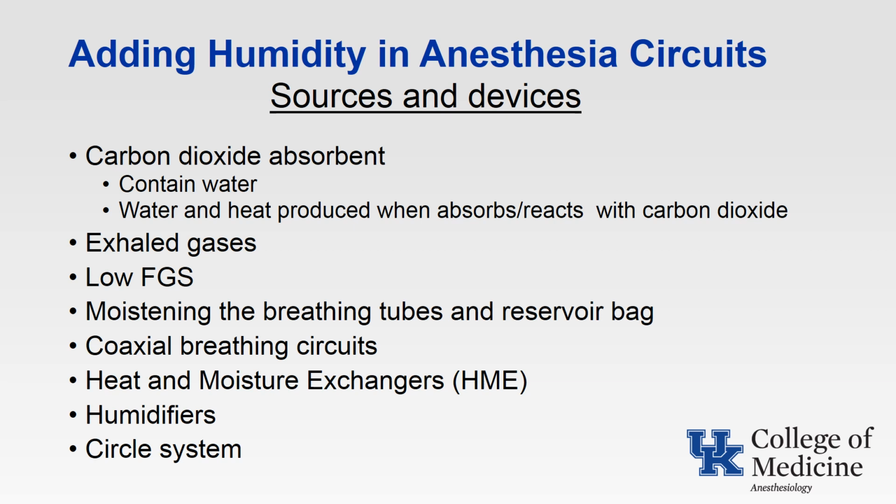How can we add humidity to the anesthesia circuit? I've listed on these slides various ways: CO2 absorbent, exhaled gases, low fresh gas flow, moisturizing devices, adding moisture in breathing tubes and reservoir bags, use of coaxial tubings, and other systems.